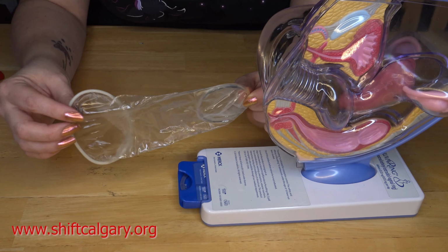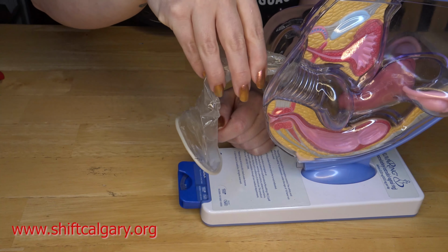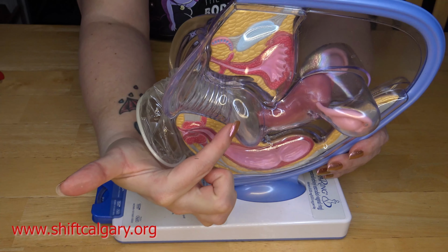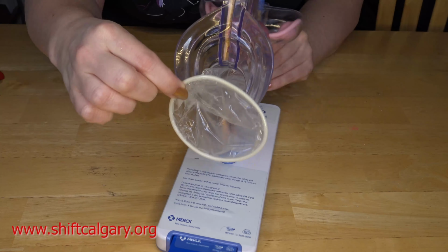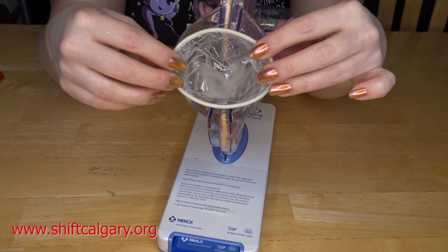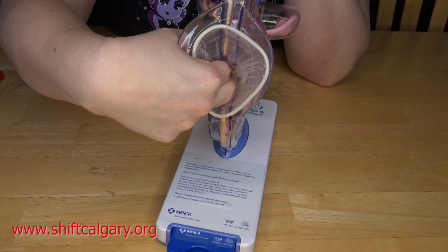Now the way we use it is this ring gets pinched and inserted. The ring part then lands up inside the vagina or the anus. What we now have is it hanging out and it's open. This is where the penis enters. So when the insertion happens, it goes in here.